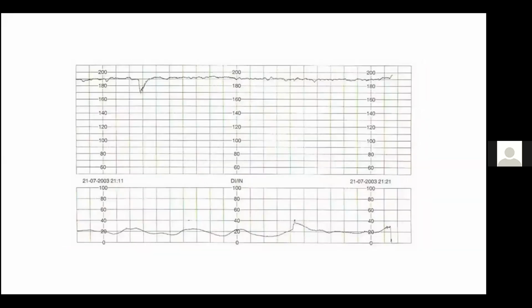And then we also talked about the issue of the strength of the contractions. If you see this CTG tracing, we're still talking about contractions. If you look at these contractions, they look shallow. You can count the numbers. When we look at contractions, we do not talk about strength of contractions. You're not going to find this patient screaming in pain, and you say, what's wrong with this mommy? Because she hardly has any contractions on her CTG, yet she's screaming. No, this patient is obese. What happens is that if there is a fat barrier, it impedes the ability of the toco belt to sense the contraction. And therefore the tracing will look shallow when you look at the toco, but the contractions are strong. So don't focus on that. Just focus on the number, the shape, the form, and the duration.